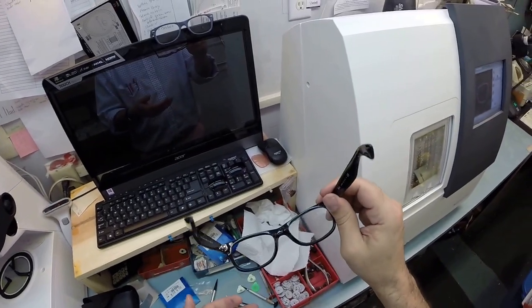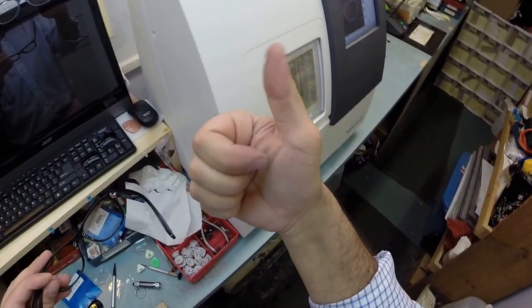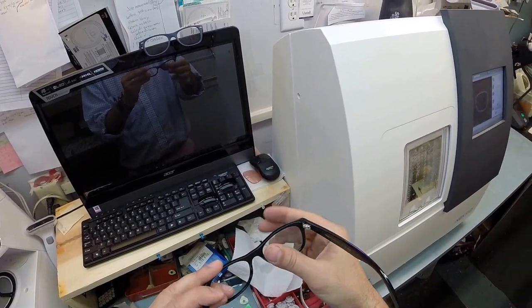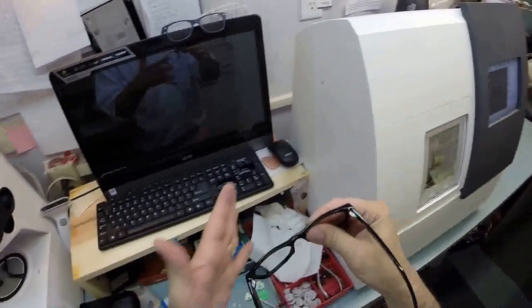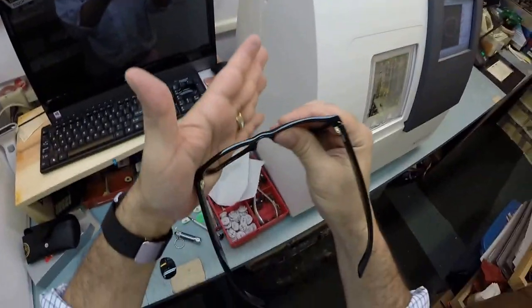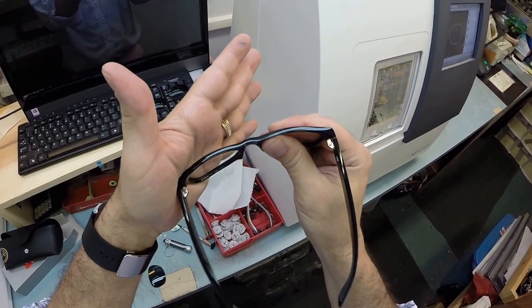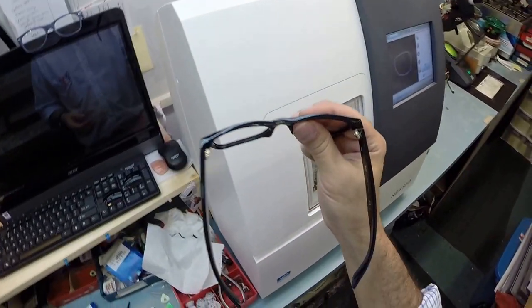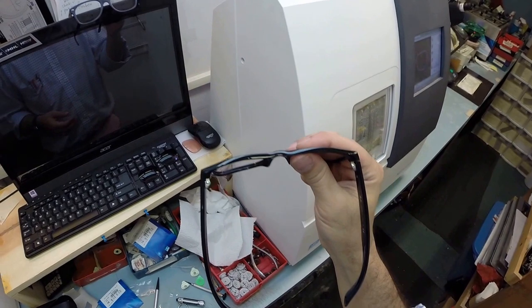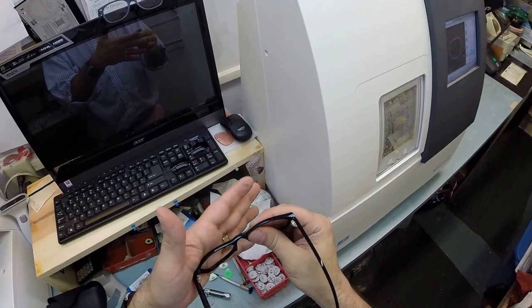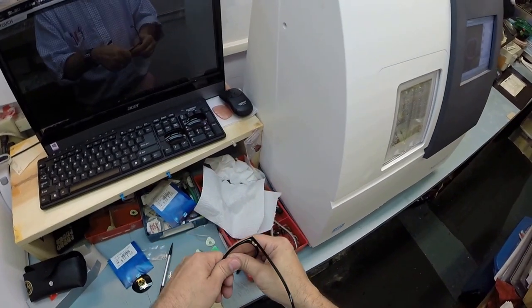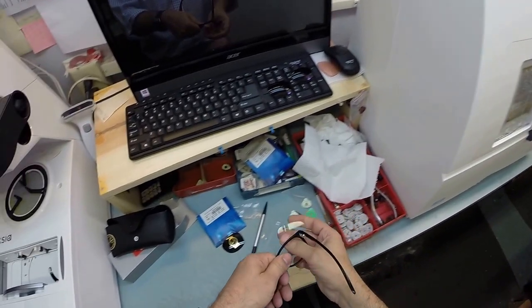We know what the sun's harmful ultraviolet rays can do to your skin. Your eyes are eight times more sensitive than your skin, so you have permanent sunscreen for your eyes. But to remove the lenses, I'm right-handed, I tell people you just have to thumb your nose at the idea. You're going to place your thumb at the nose and grab the lens by the other side. Now you can torque the frame, you're not going to hurt your frame as long as it's at room temperature. All you have to do is put your other thumb on top, push down, and out come your lenses.